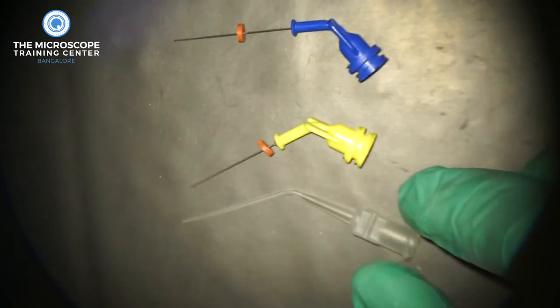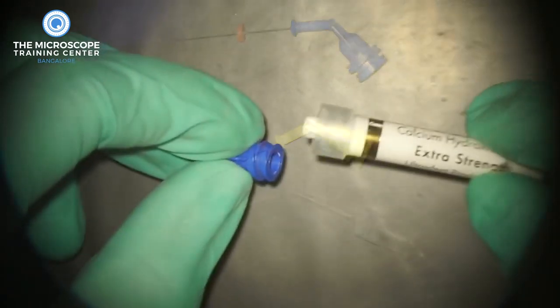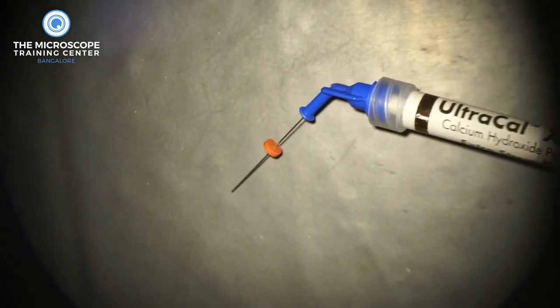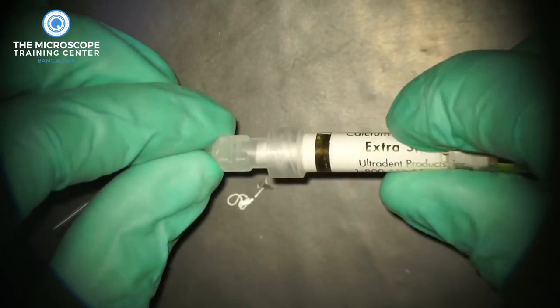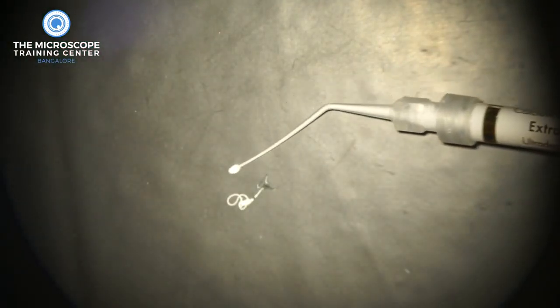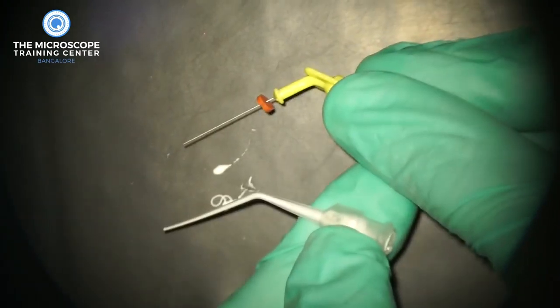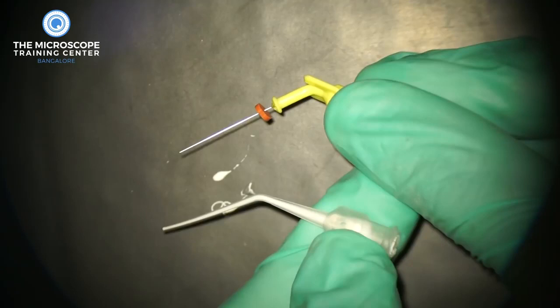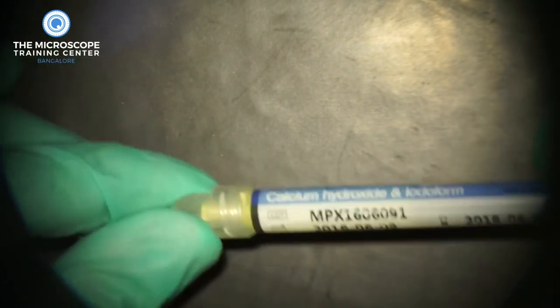For inserting calcium hydroxide into the canals, we use delivery tips. We use navy tips from Ultradent, or you have plastic delivery tips from multiple companies. The top two — the blue and the yellow — are navy tips, and these are the easiest to use. You insert them into the calcium hydroxide tube, adjust the stopper, and extrude it into the canal. The plastic tips are used the same way. The Metapex — thicker calcium hydroxide mixed with iodoform — cannot be injected through the navy tips because the navy tips are too small, so for Metapex we use the bigger plastic tips.